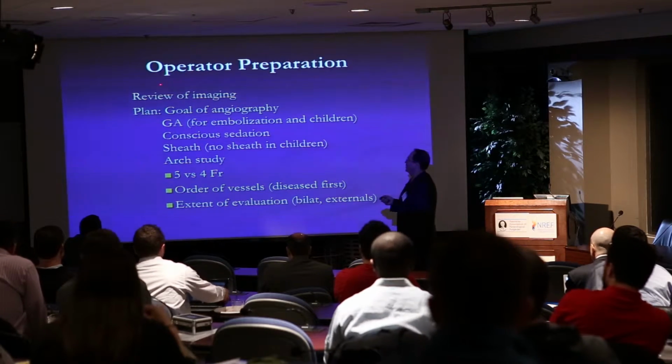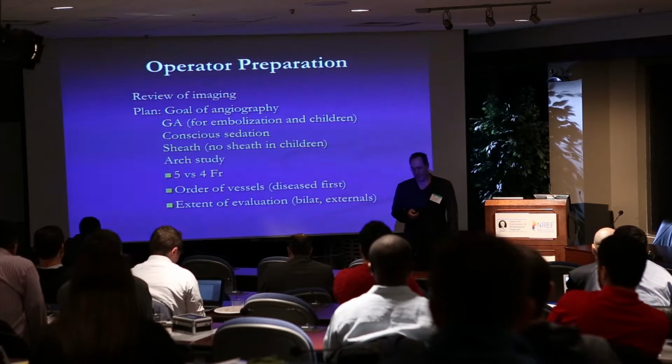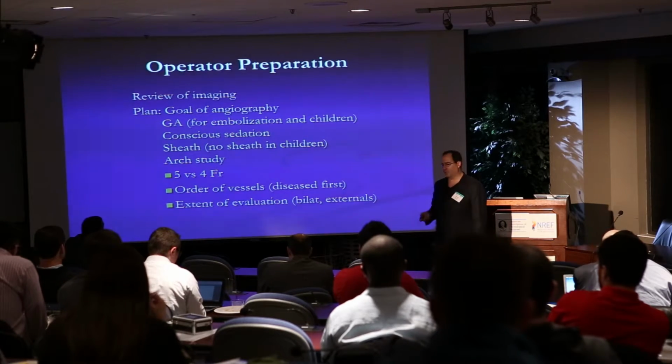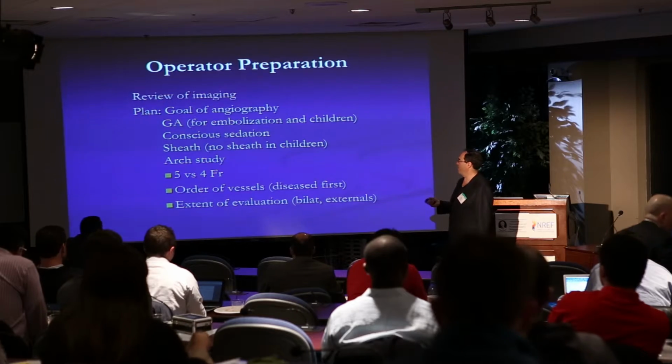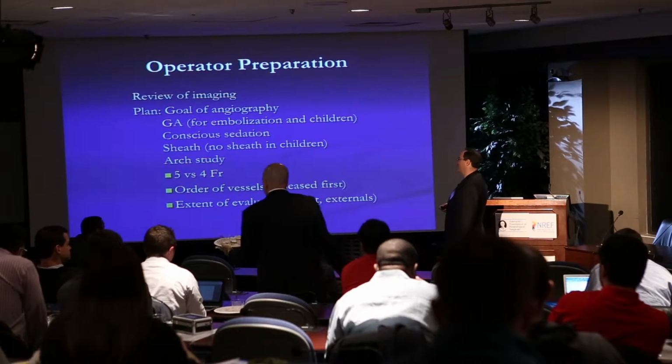One of the most important things, and this should go back to the earliest days of your residency and medical school, is reviewing the imaging. It seems it should be easier now with everything being in the digital medical record, but when I was training, we had to search for cut films. Lou Kim, who was the junior resident in Phoenix when I was a fellow, would disappear for hours looking for the cut films for the cases for the next day. That was so that we all could review the imaging before the case. Understand what you're going to do and what your goal of the angiography is going to be.